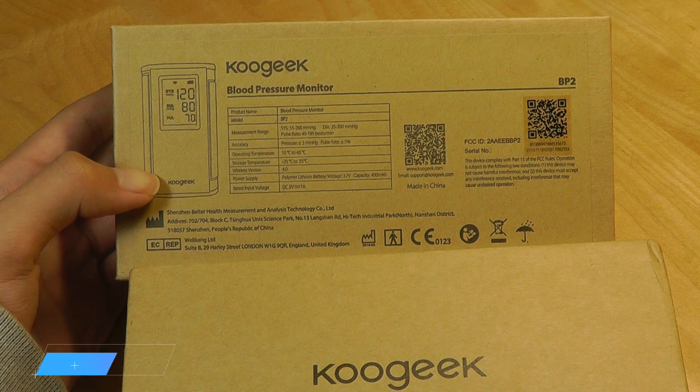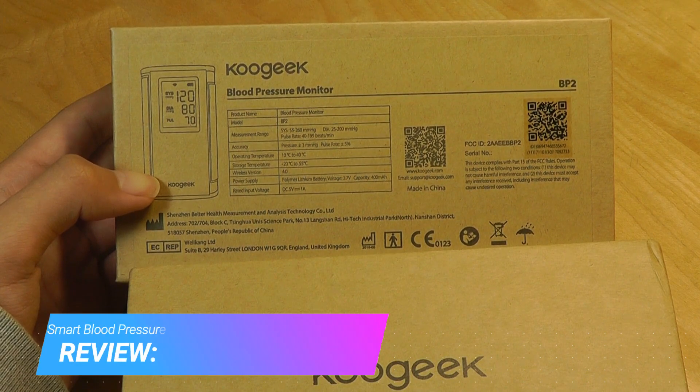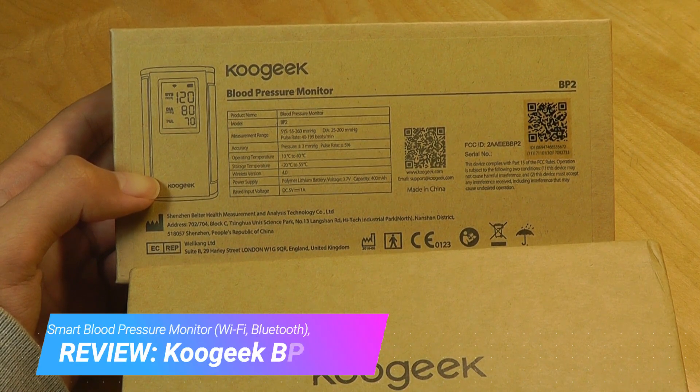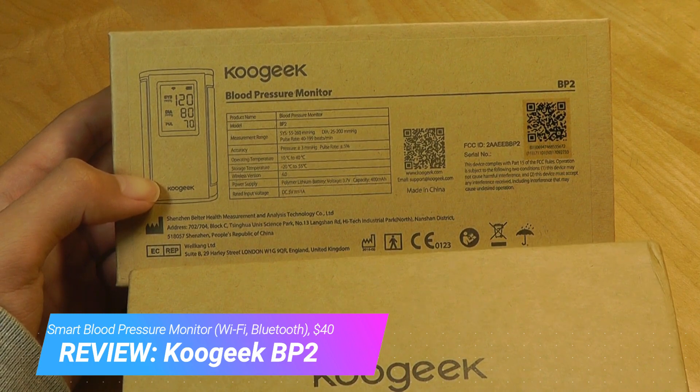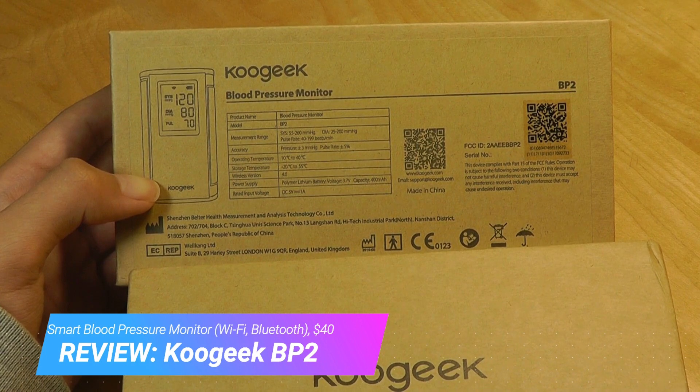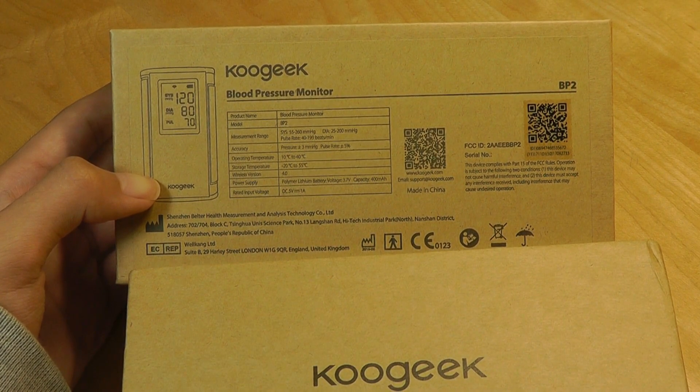Hey y'all, here at OSReviews. Recently we're checking out some more connected smart home products, and today we're taking a look at the KuGeek BP2, which is a blood pressure monitor that has both Bluetooth and Wi-Fi to connect onto a smartphone companion app, either iOS or Android, and then you're able to monitor those health stats from there.